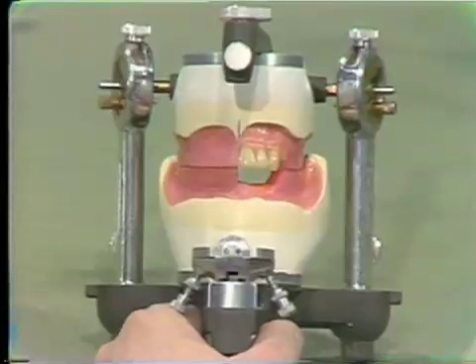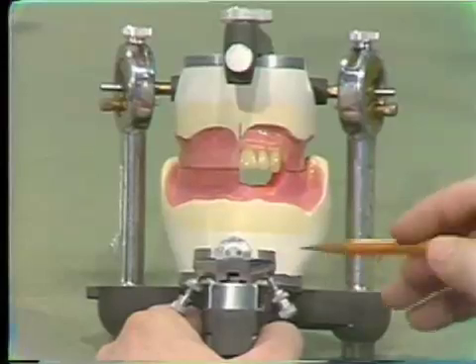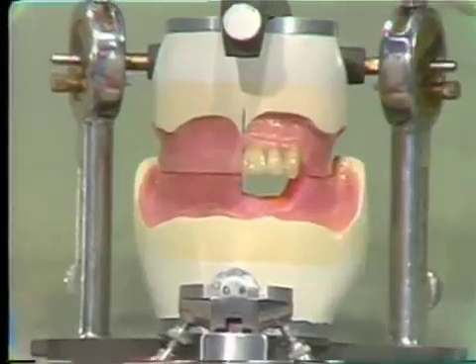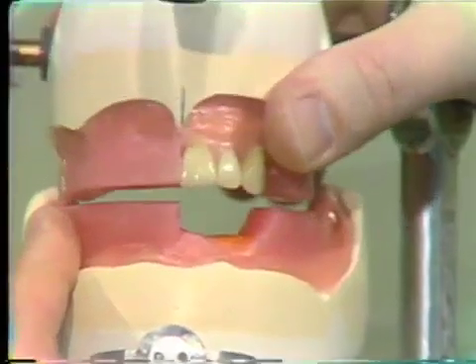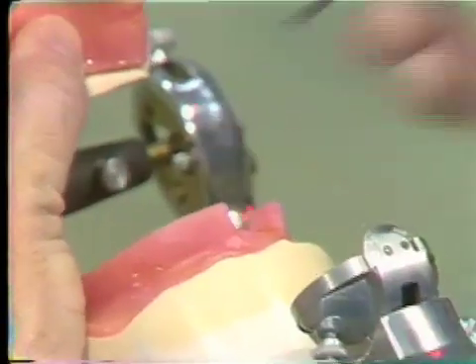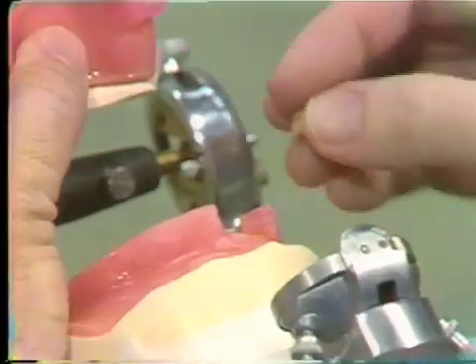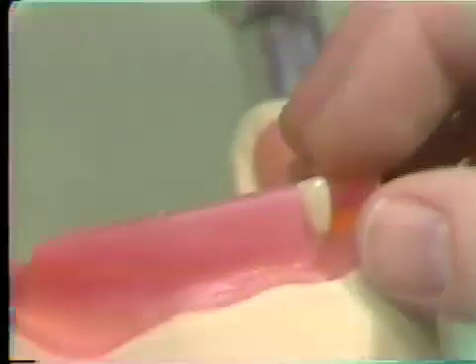In setting the lower denture teeth, the first step is the same step that we used for setting the upper. That is, we remove a block of wax in the lower area back to the approximate bicuspid area from the midline over. We're using the midline as a guide, of course, so we maintain that midline. And then our central incisor is set so that it follows the contours again of the rim, which is being used as a guide, and it also has a couple of other characteristics, and I'll point those out in just a moment once I get this central incisor set correctly.